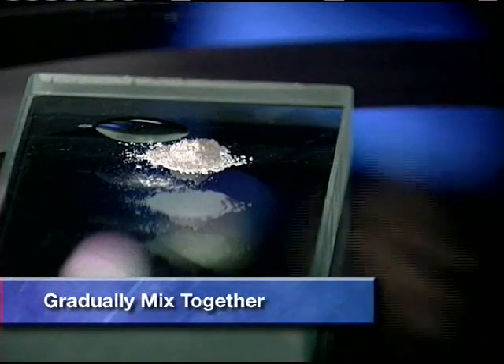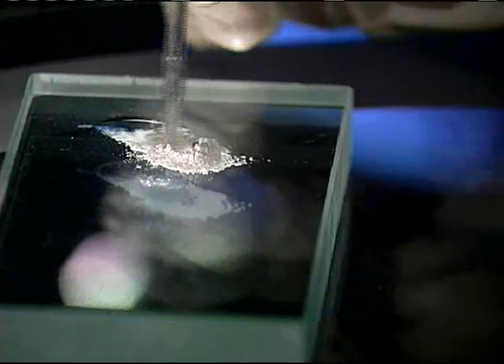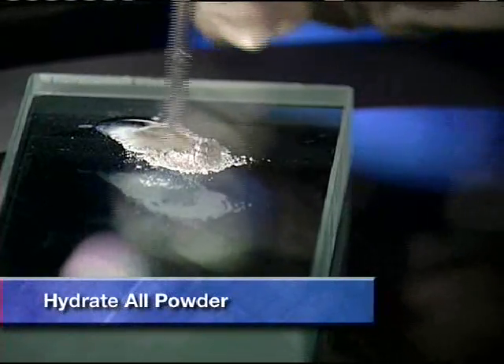Gradually mix the dry powder and the liquid components together with the mixing stick provided. Mixing should take at least one minute to ensure that all the powder is hydrated.